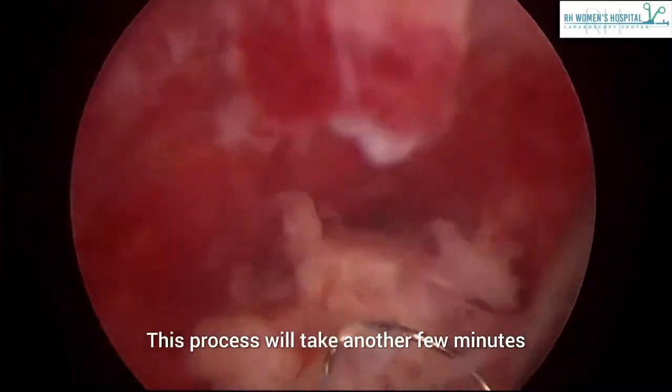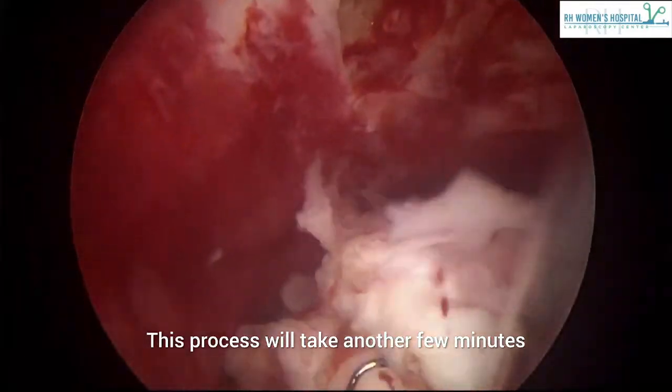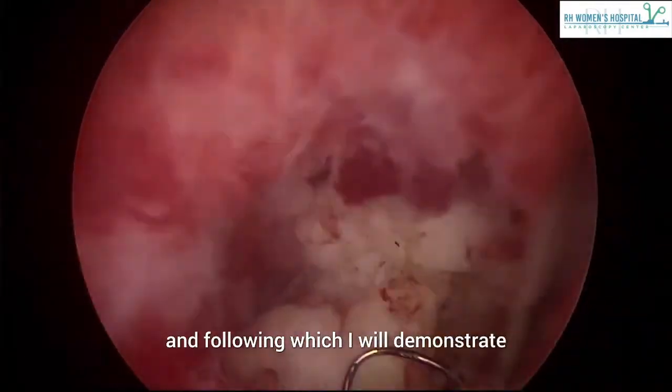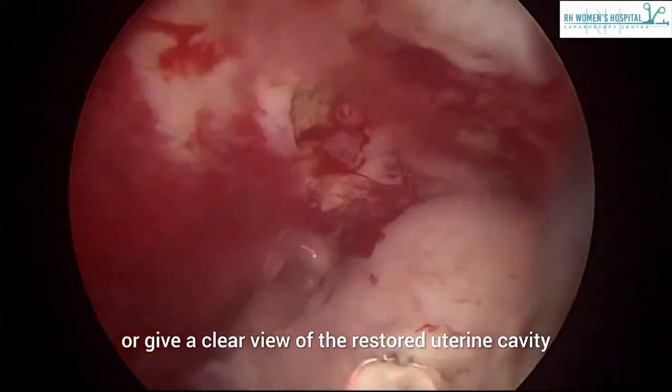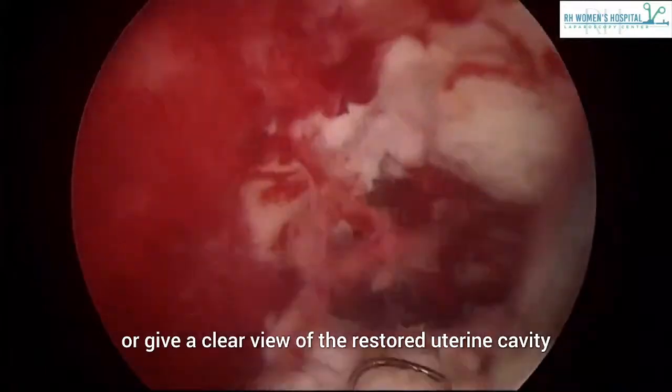This process will take another few minutes, following which I will demonstrate or give a clear view of the restored uterine cavity.